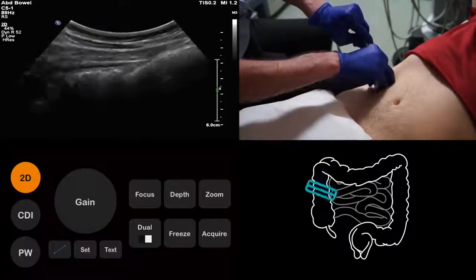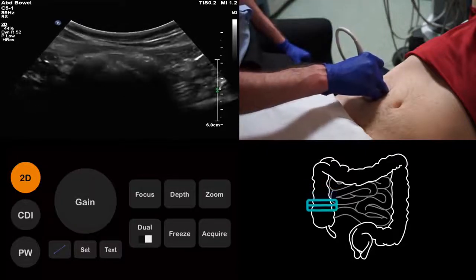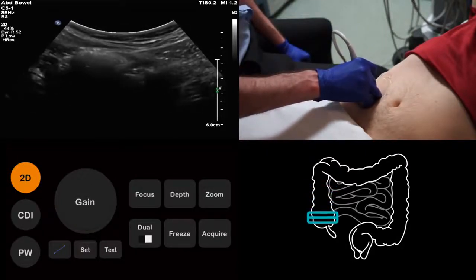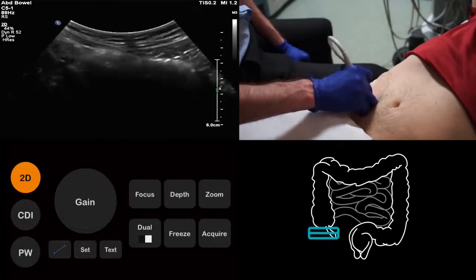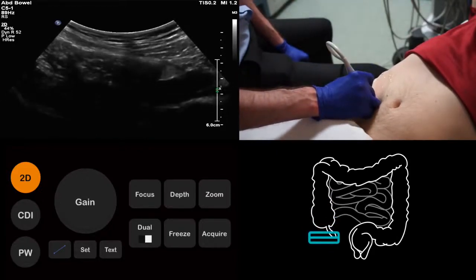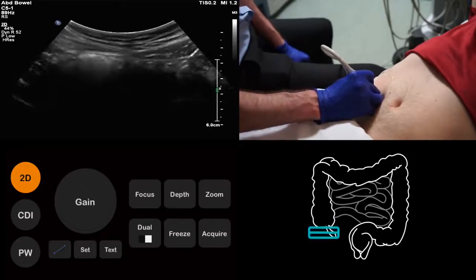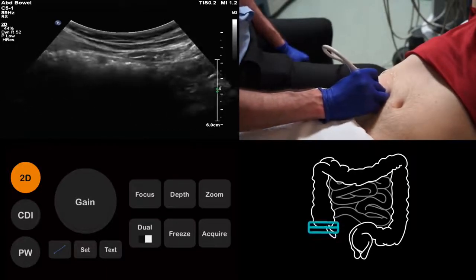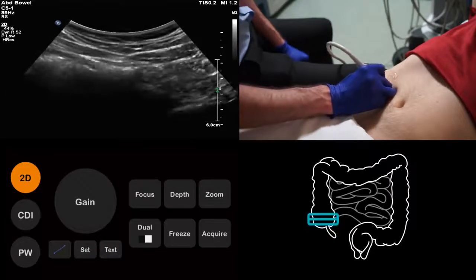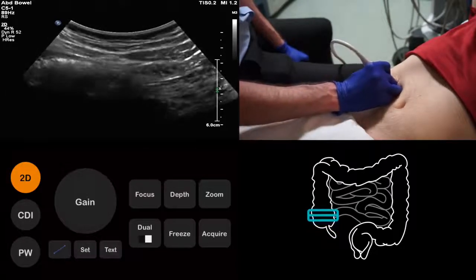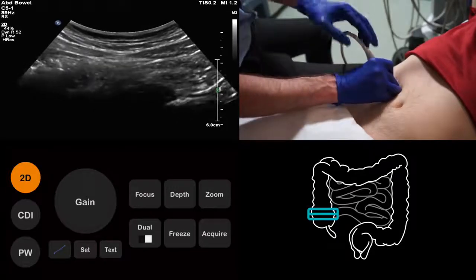Now we scan caudally. We pass from the ascending colon into the cecum, and then continue inferiorly until we have come off the inferior end of the cecum. At this point, we scan back up again. We are now looking for the terminal ileum. Finding the terminal ileum is important, because pathology here can mimic appendiceal pathology.